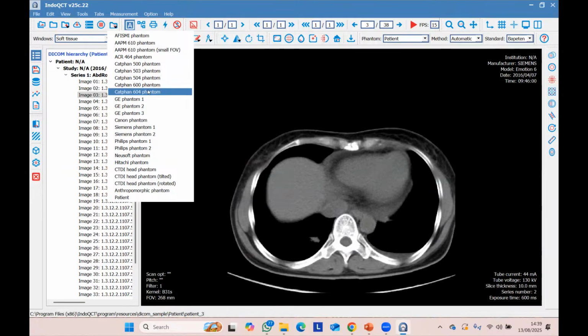But those two materials in this particular phantom, 604 or 602, I think they were swapped between Bone 50% and Delrin, because the manual says it is higher in electron density, but the expected range is less. So I don't know, is it something that I don't understand? I found this finding and I'm just talking to myself. I have yet to discuss it with any other experienced physicist like yourself.